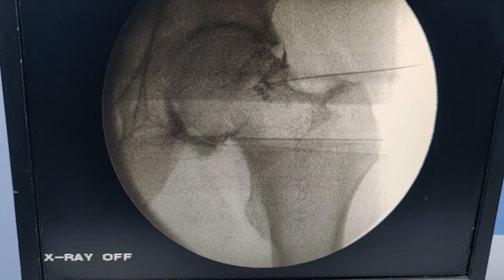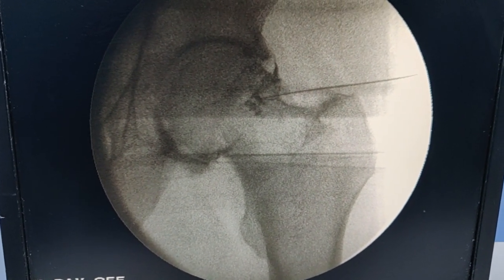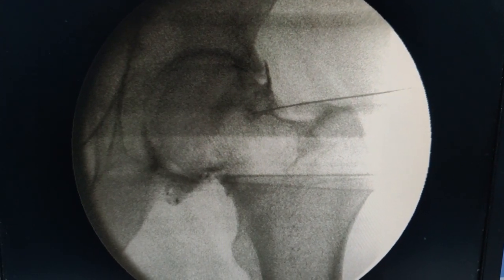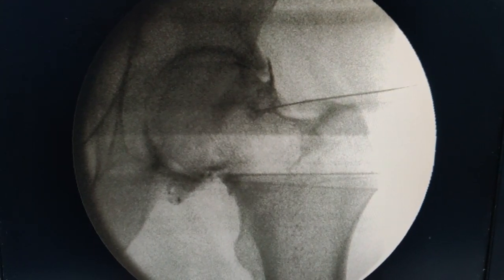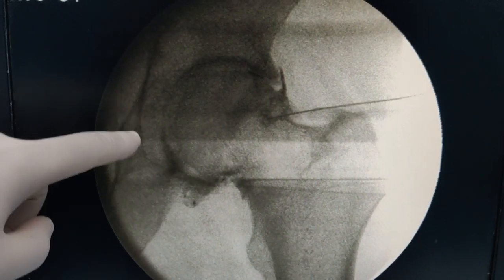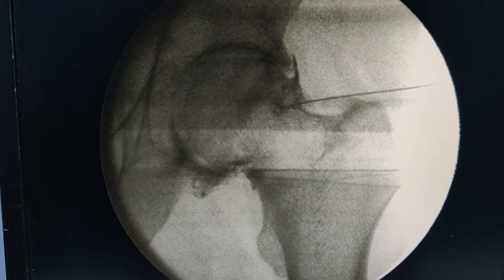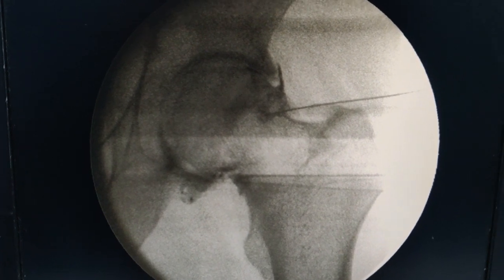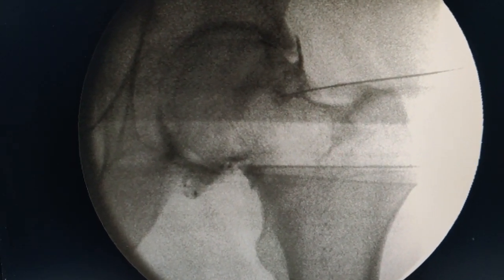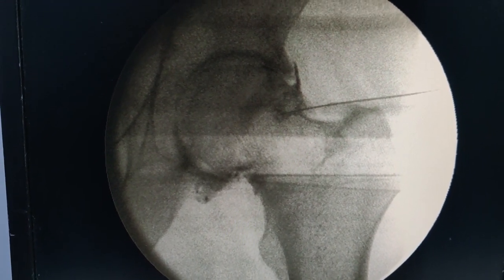Initially I tried and it was not advancing, so I had to readjust my position. Now you can see that the contrast is nicely flowing — it has gone inside the capsule and has taken the shape of the femoral head. We are now sure that the needle is in the joint. Always use the dye so that you are 100% sure your drug is injected at the right place.